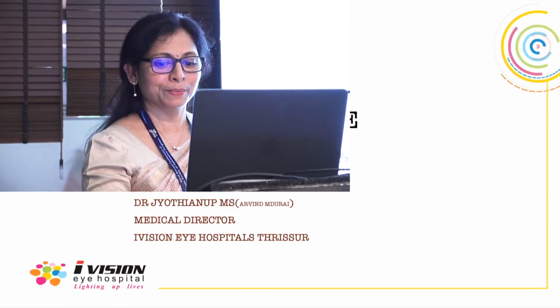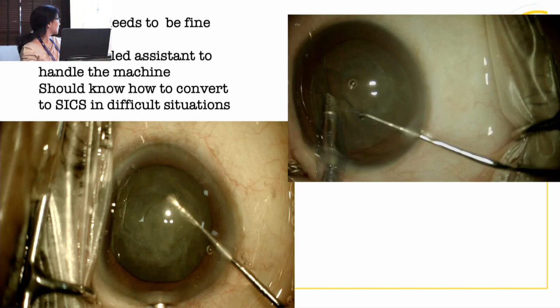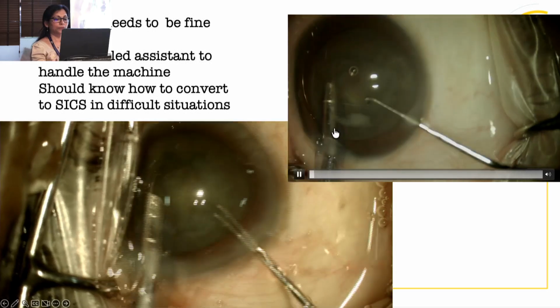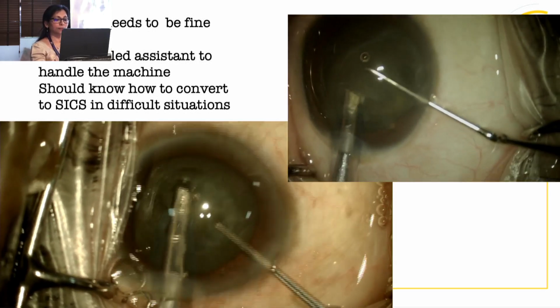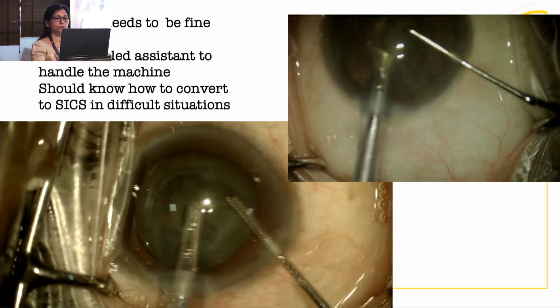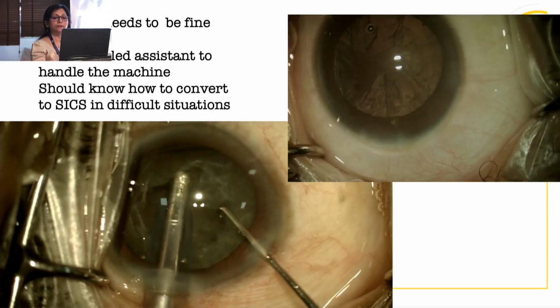My topic is about day-to-day problems while doing phaco. So whatever Dr. Shobha and Dr. Anjana told about the problem, I'll be showing some of the problems. So in the beginning, it is very tempting to take soft cataracts, but phacoemulsification of soft cataracts is not that easy. As you can see here, I'm struggling. If you go deeper, then you may end up with a posterior capsular rent. If you go near the periphery, you may end up with a zonular dialysis.